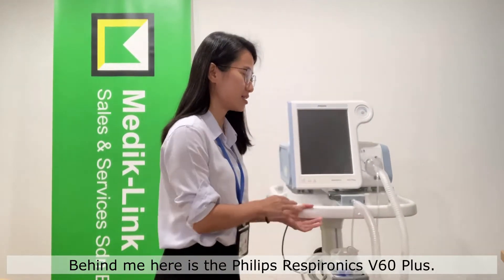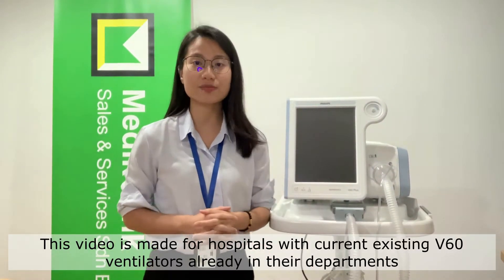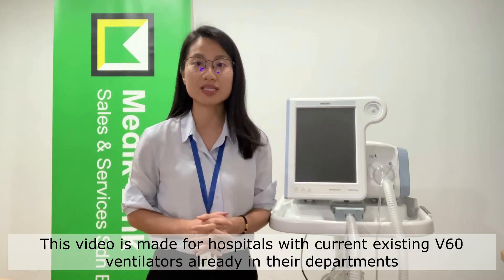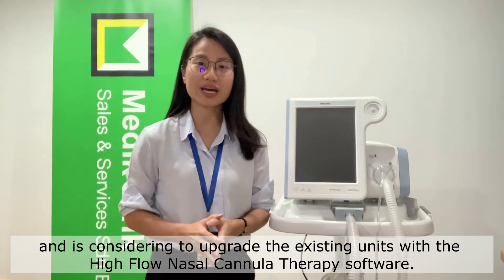Behind me here is the Philips Respironics V60 Plus. This video is made for hospitals with current existing V60 Ventilators already in their departments and is considering to upgrade the existing units with the high flow nasal cannula therapy software.